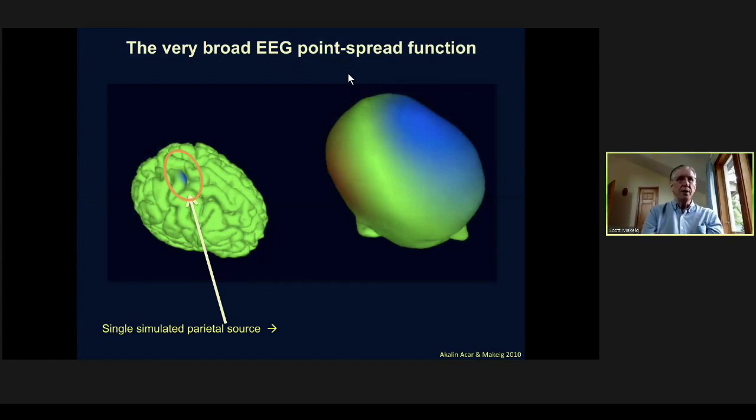Now let's turn to the EEG. Here is an electrical head model put together by Zeynep, Kaeland, and Char. And I asked her to show a synchronous activity across some small portion of cortex. Here, projecting blue, which is our code for negative signal.